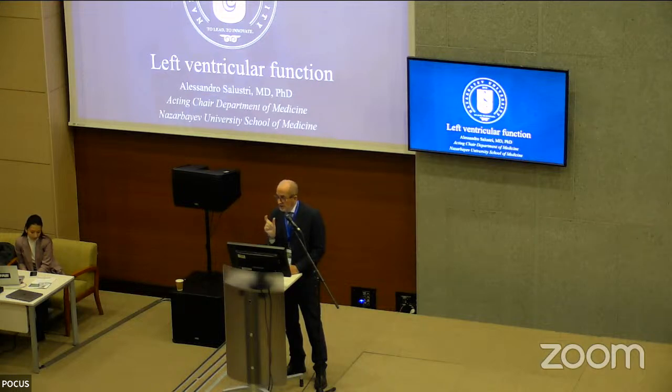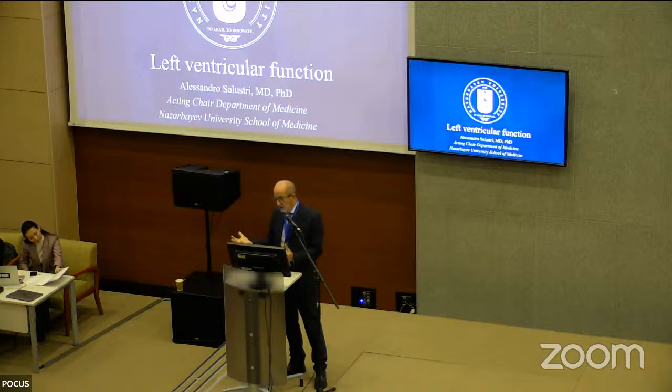However, the ejection fraction is the ratio between stroke volume and diastolic volume. So if the ventricle is dilated, even with the normal stroke volume, you may have low ejection fraction because of the dilatation of the ventricle. So VTI does not take into consideration the LV volume.